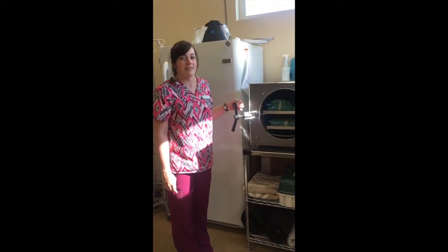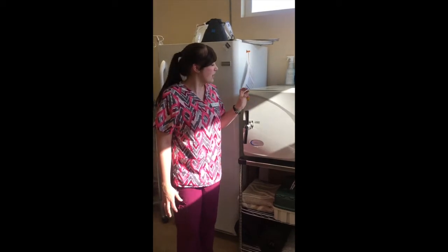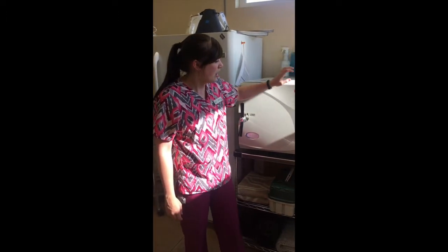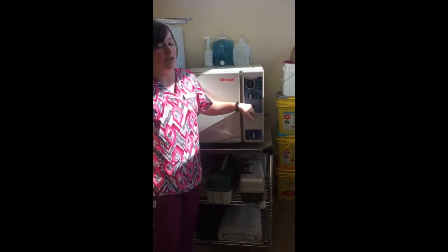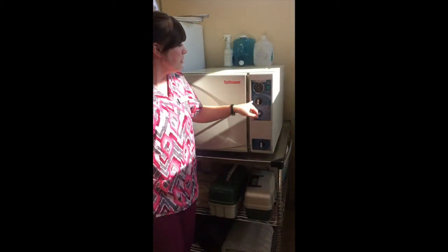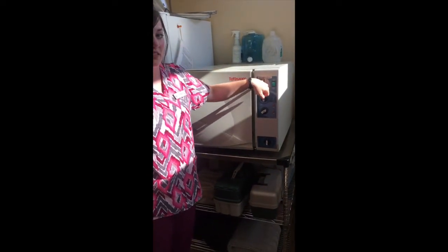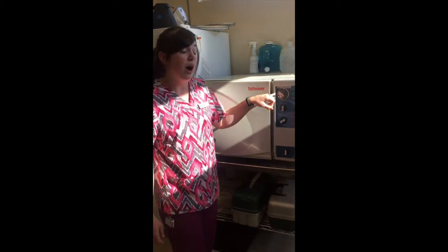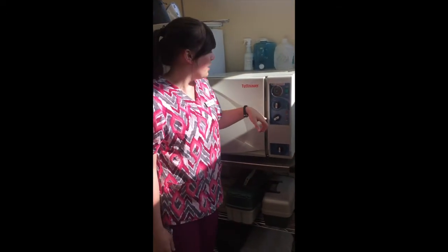Okay, so I'm going to talk about the proper time and temperatures for autoclaving. If we're going to autoclave wrapped packs, we want to make sure our temperature is set at 273 degrees Fahrenheit. The pressure that it gets to is 30 psi. Anything above that becomes dangerous, so you should watch your autoclave and make sure there's not a problem if the pressure gets too high.